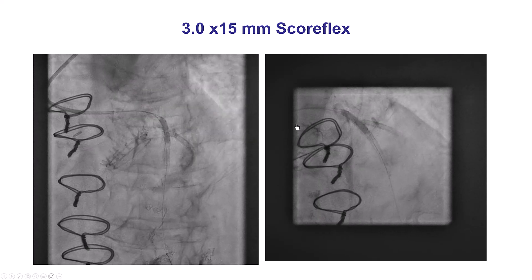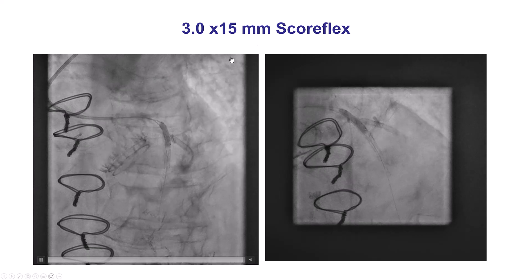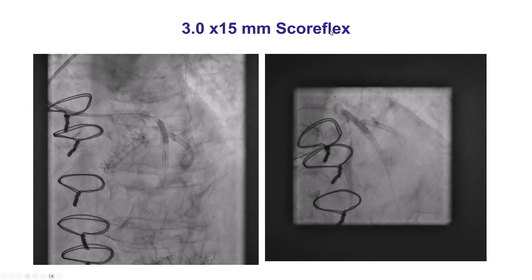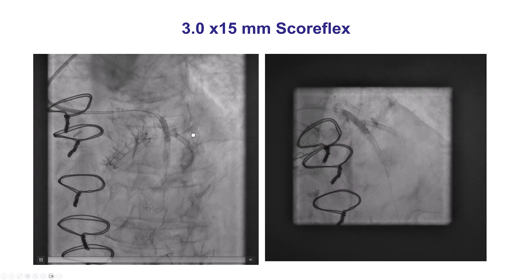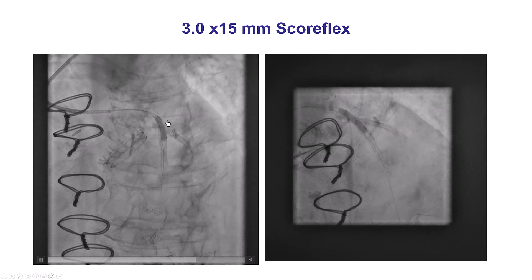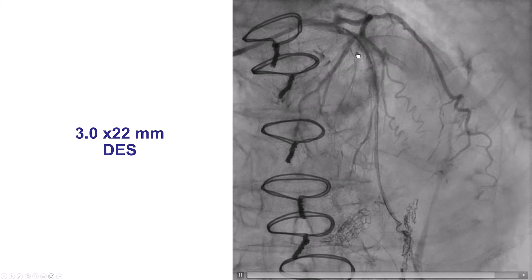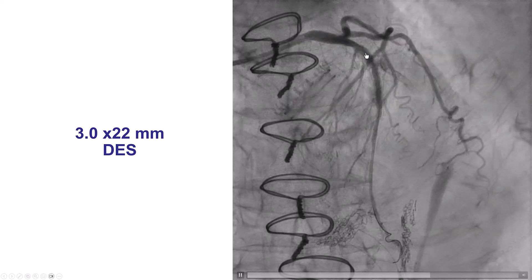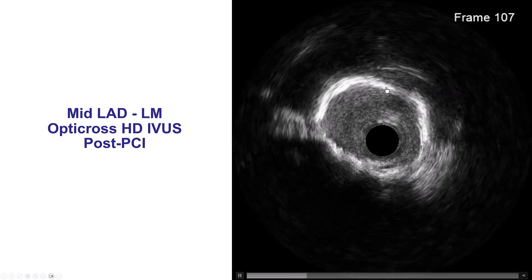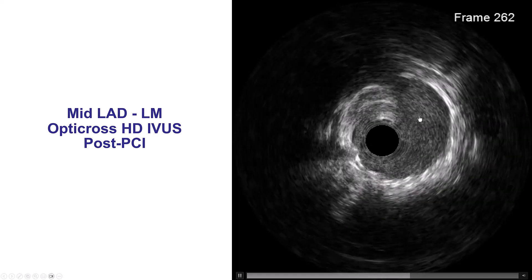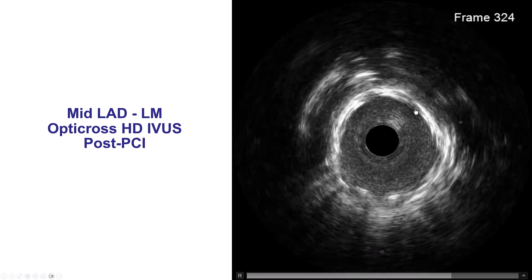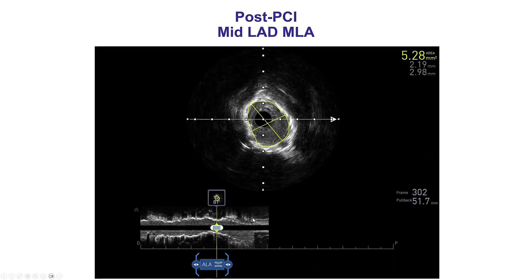Well, we were getting ready to do laser with contrast. However, we decided to try a plaque modification balloon, which we had not done before. So this is a Scoreflex, 3.0 by 15 mm Scoreflex. And to our surprise, the Scoreflex actually seemed to expand fairly well. We did intravascular ultrasound and ended up placing an additional stent. After the second stent, there is much better expansion. There's still an area that is not perfectly expanded, measuring 5.3 mm squared — we would like to get it a little higher — however, significant improvement compared with baseline.